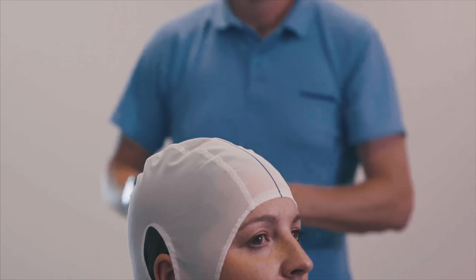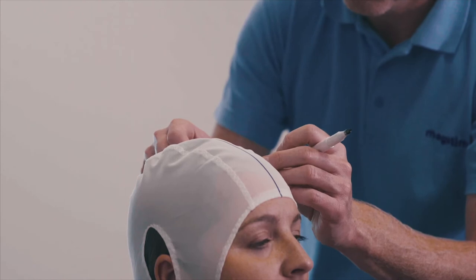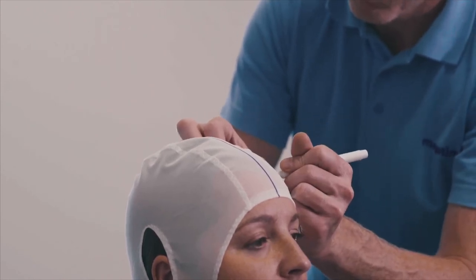From your defined hotspot, measure 5.5 centimeters towards the front of the head, parallel to the midline marker. Mark this spot as the treatment location.